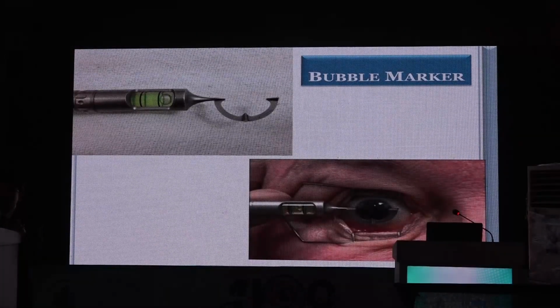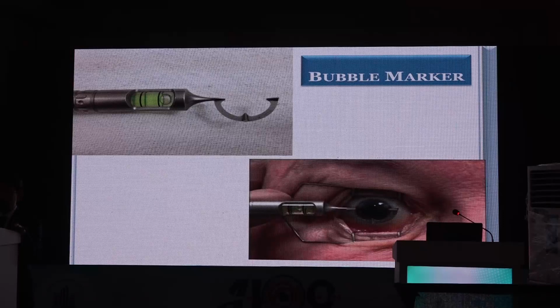The most popular method of marking the cornea is the bubble marker. Here you have a bubble, as you can see. It should be in the center, and then you put some gentian violet over here, place it over the cornea and mark it.